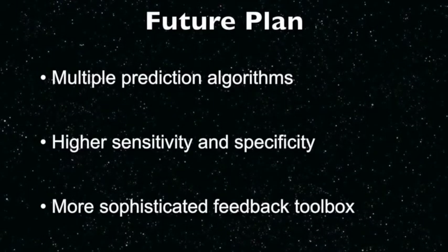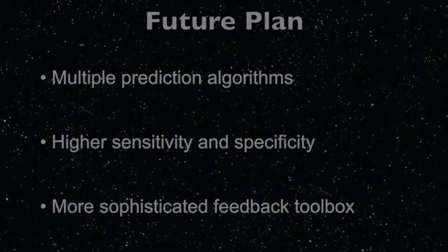To proceed our work from this semester, we're planning to make use of multiple prediction algorithms combined together to further improve the sensitivity and specificity of our model. Besides, we're also designing a more sophisticated feedback toolbox that allows doctors to mark and draw on images more freely.